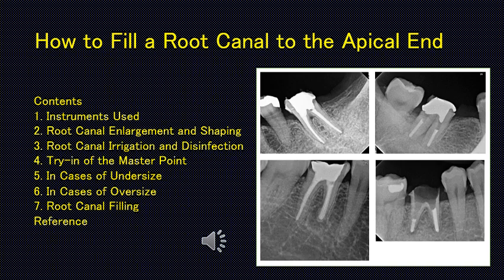Contents. 1. Instruments used. 2. Root canal enlargement and shaping. 3. Root canal irrigation and disinfection. 4. Try-in of the master point. 5. In cases of undersize. 6. In cases of oversize. 7. Root canal filling. Reference.